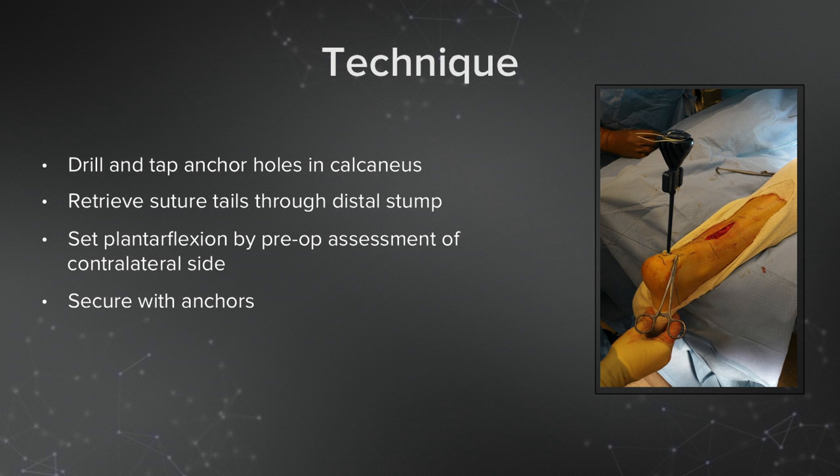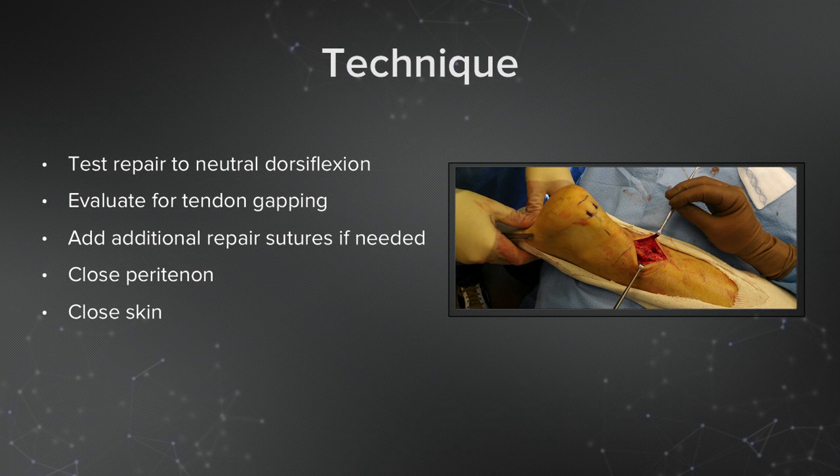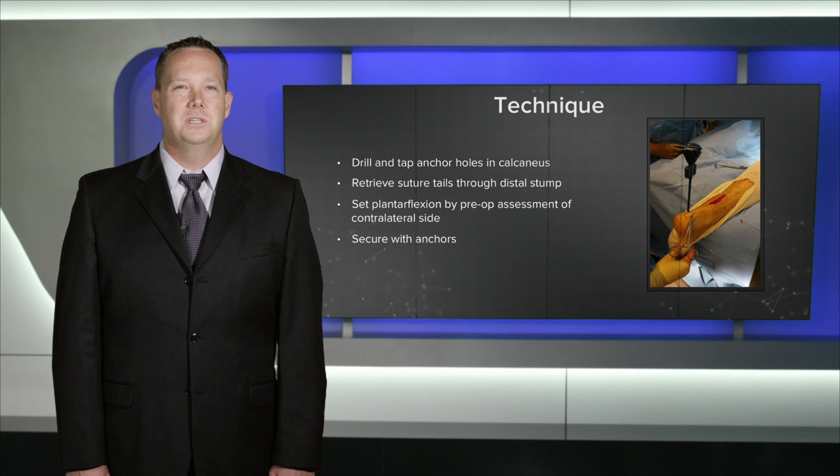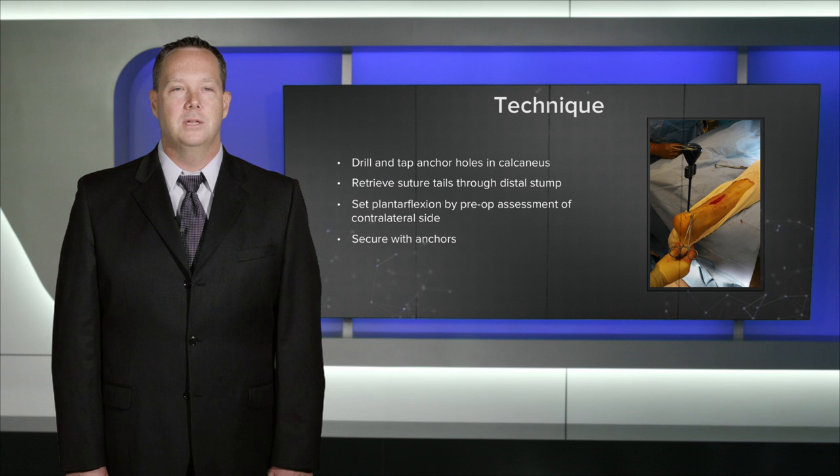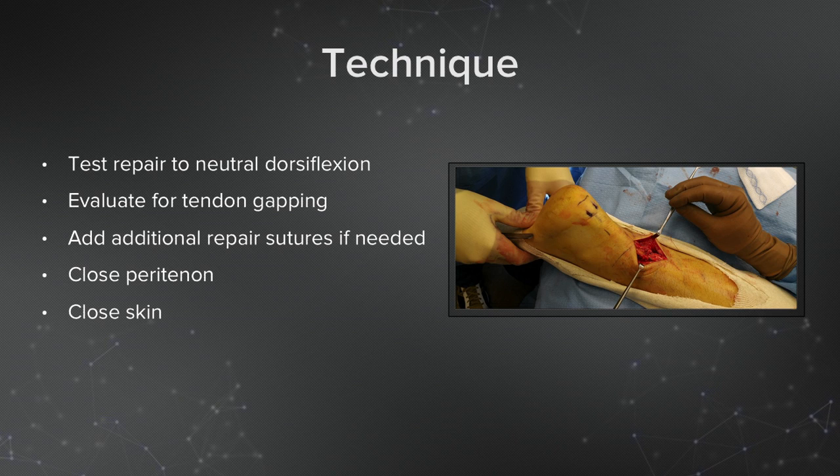I'll then secure the tendon with the swivel lock anchors. After the repair is done, I'll test the strength of the repair by dorsiflexing the ankle to neutral dorsiflexion. If I see any tendon gapping or any loosening of the repair, I'll add some additional locking sutures at that time. Then I will close the peritenon and close the skin in a standard layered fashion.